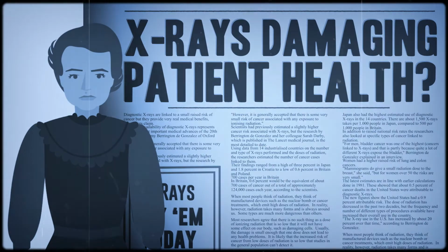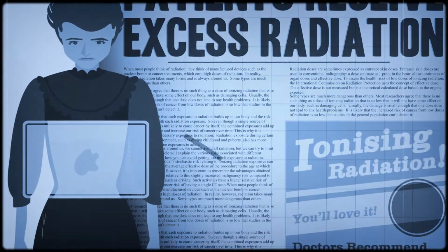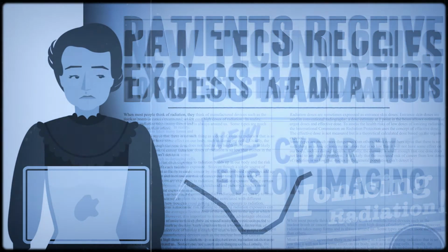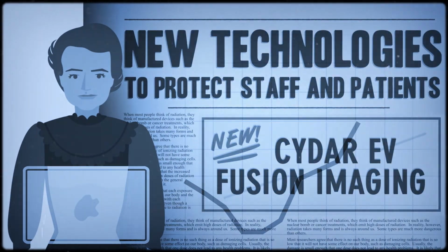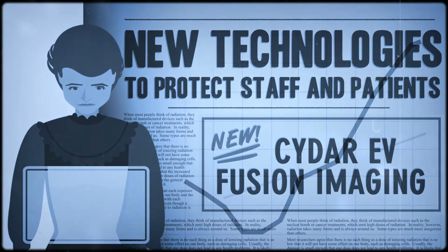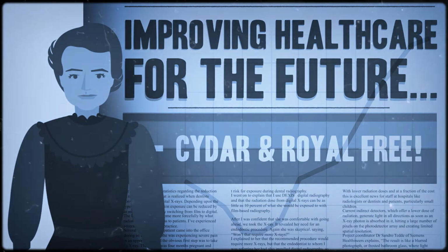Dose audits which compare local doses to published dose values for similar procedures can highlight areas for potential further optimization. Sometimes high patient doses are unavoidable, and if there is a risk of skin injury, patients should be followed up after reaching local trigger levels. Typically, 5 Gray reference point Kerma or DAP greater than 500 Gray cm squared.